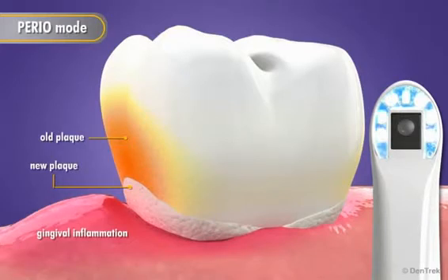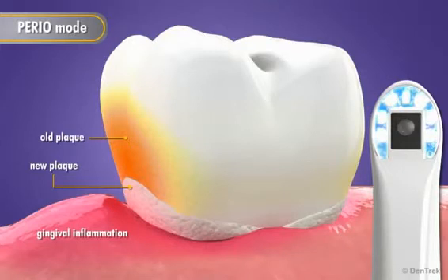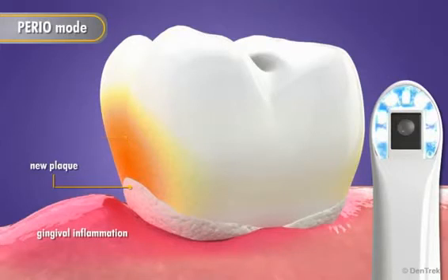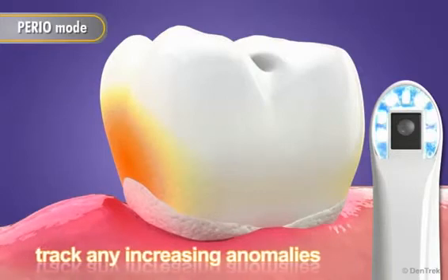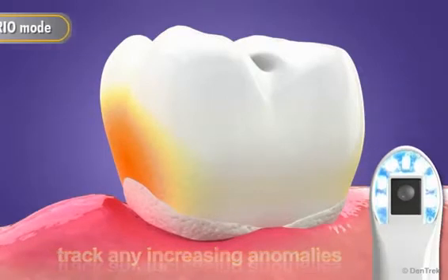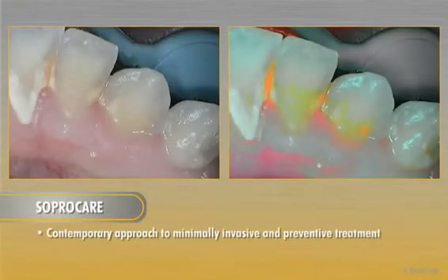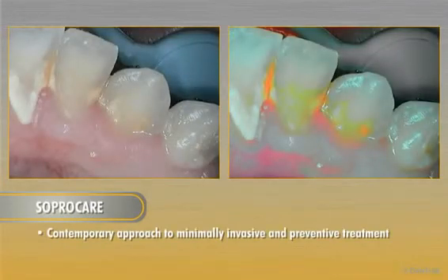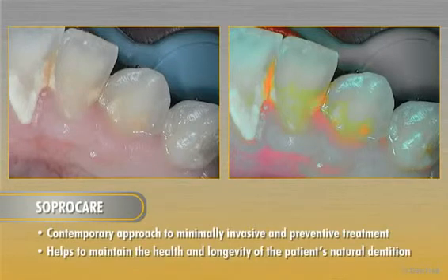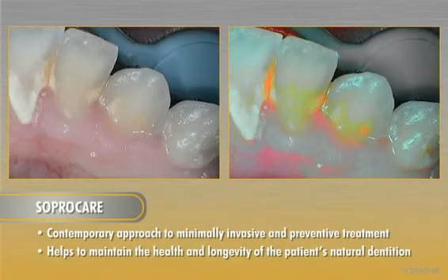Perio mode not only reveals plaque and gingival inflammation but also allows the dental professional to track any increasing anomalies. SoproCare guides the dental professional with a more contemporary approach to minimally invasive and preventive treatment, helping to maintain the health and longevity of the patient's natural dentition.